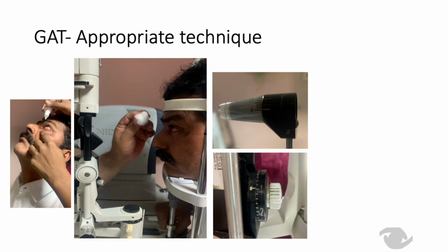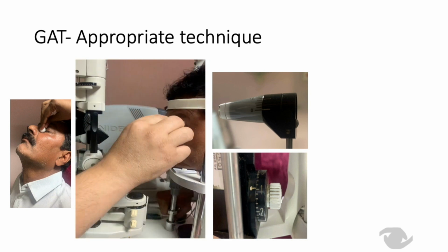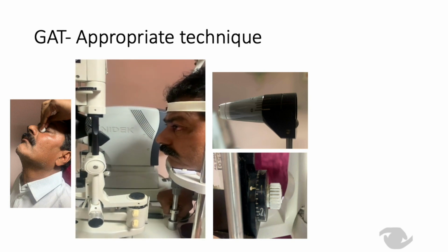After explaining the procedure to the patient, Paracaine eye drop is instilled. The patient is seated comfortably with the forehead and chin in contact with the head and chin rest and outer canthi in line with the mark on the slit lamp frame. The zero mark on the prism must align with the white line on the prism holder. The dial on the tension knob is set at 1 gram mark. Fluorescein strip is applied to the conjunctival cul-de-sac and the patient asked to blink. The tonometer assembly is rotated in line with the oculars.